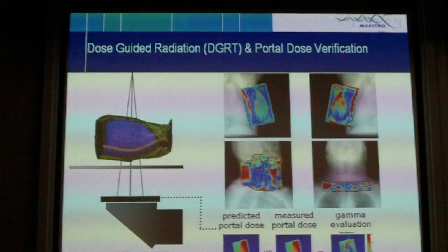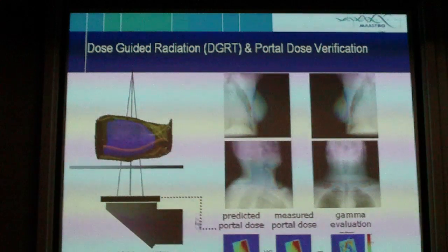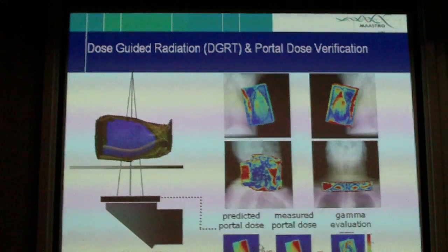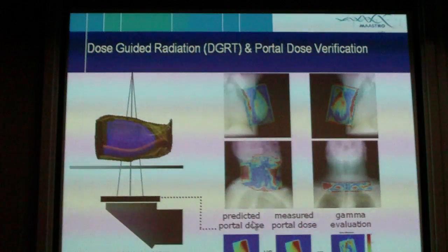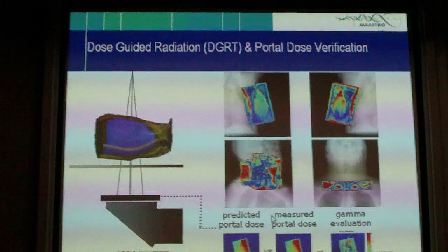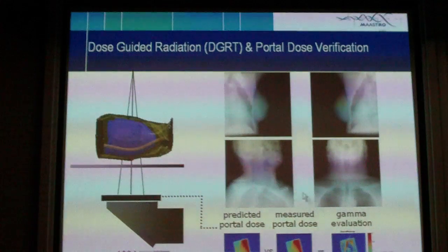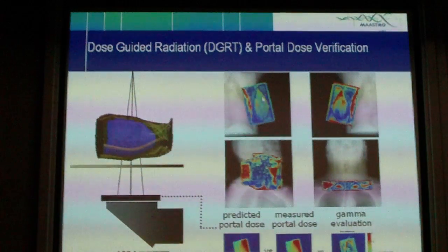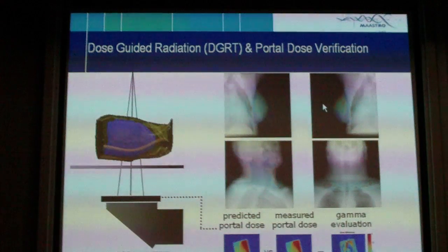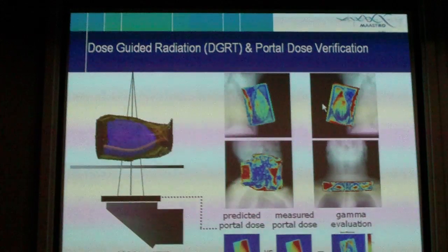and you make sure that, so during irradiation, this is a patient, irradiation. So during the treatment, you activate your imaging panel, as shown in the beginning of the lecture, and you can compare what is predicted, from your treatment planning, and what's measured from the actual treatment itself. And you can make the difference of it, and you see this in different colors. So bluish indicates that predicted versus measured is okay. More red indicates that there's an error. So that gives you an indication how to change your treatment plan.